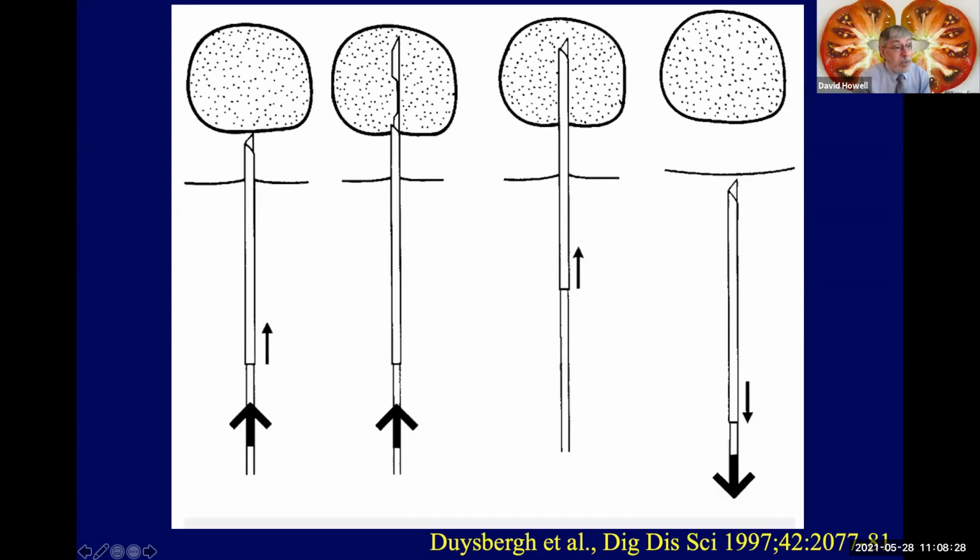So here's a diagram. This is actually from a digestive publication. I don't think this thing was originally supposed to be a kidney, but let's suspend disbelief for a moment and assume that this clear area out here is cortex and the stippled thing is medulla. The biopsy device actually has two concentric layers. There's an inner needle, and right outside of that, there's a sheath. The needle has a very sharp, occluded tip. So this thing gets pushed through the body wall up to the surface of the organ. In this case, the person doing the biopsy has pushed it a little bit too far, and the tip is actually resting at the corticomedullary junction. And at this stage, no biopsy tissue has been procured.